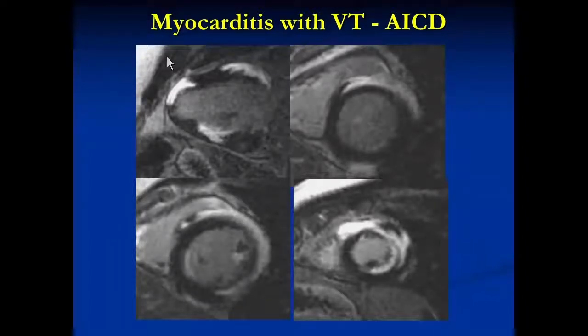You can do T2 imaging in these patients. It's very helpful, but the diagnosis comes from delayed enhancement in the subepicardium, in a distribution that is not typical in relation to the troponin rise. The rise in troponin is much lower than you would see for an ischemic myocardial infarction that would lead to such damage. And besides, the damage, as I said, is generally subepicardial.